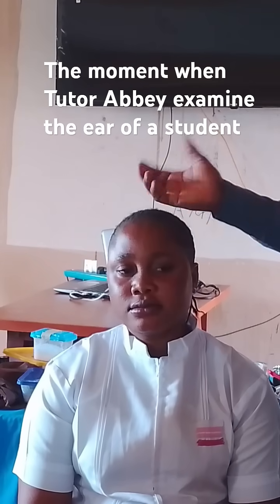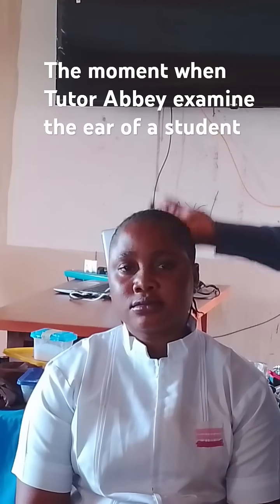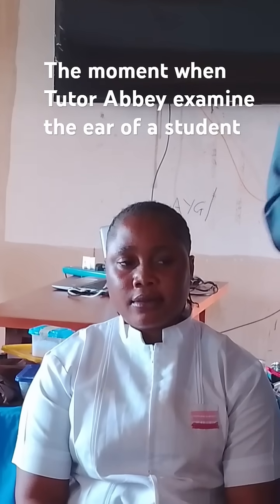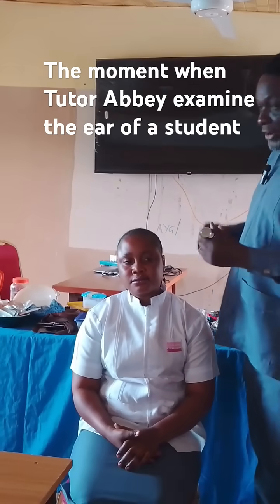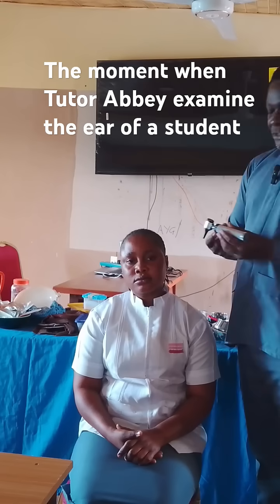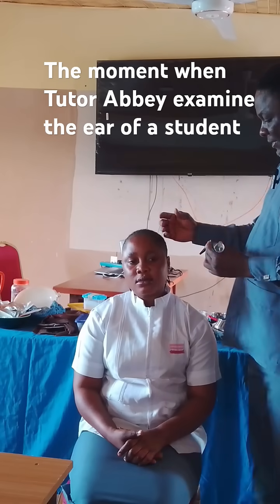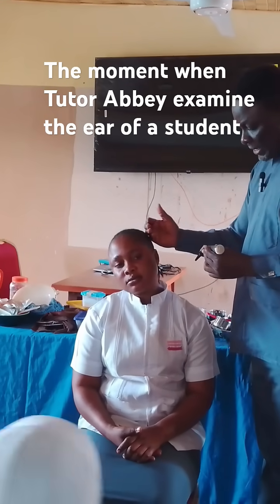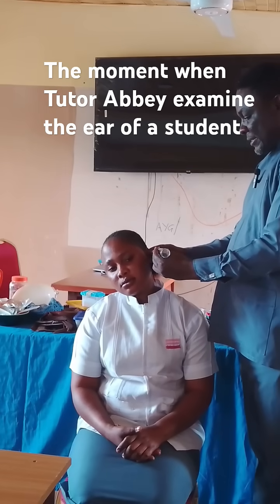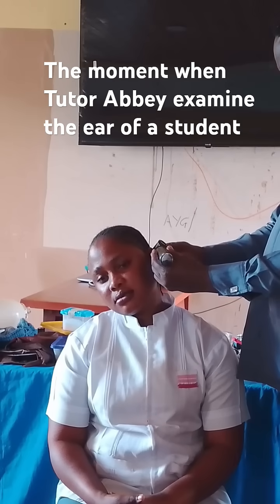So, if I want to assess her now, I don't need to bend. I don't need to bend to assess her. All I need is, I will just power on, put on the light, then I will tell her to bend her head for me too, then once I insert it, I will be able to see the ear.